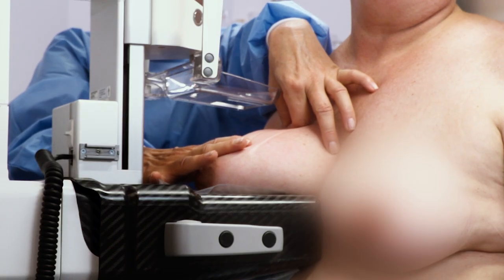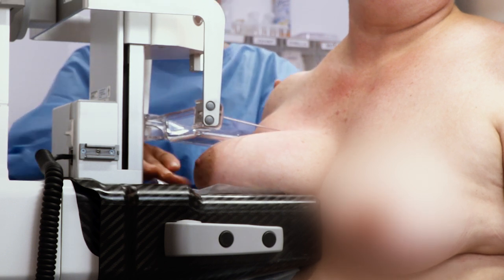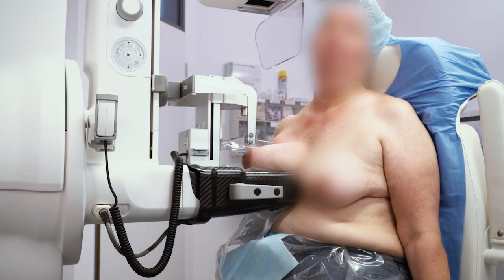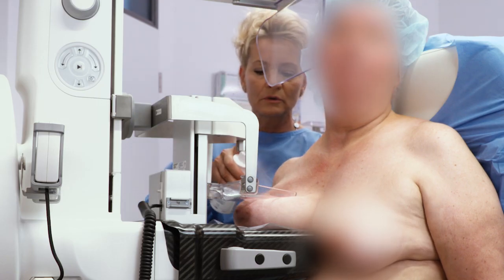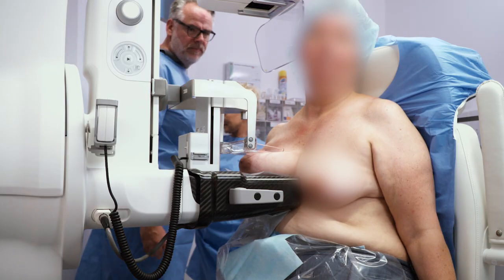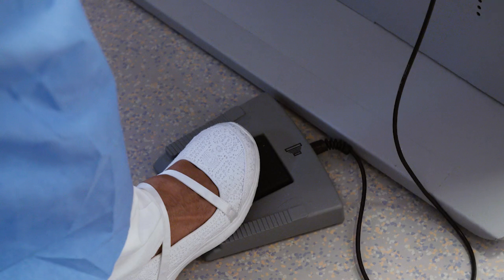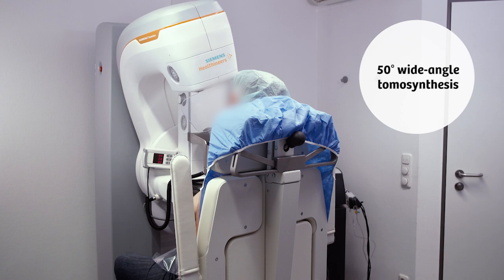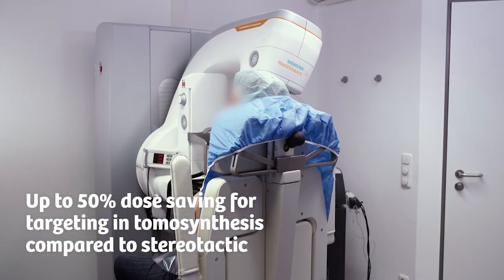Compared with previous examination time slots and times needed for stereotactic vacuum-assisted biopsies, we now have significant improvements in the workflow. That's really due to the fact that, on the one hand, we have a tomosynthesis data set, so we don't need 2 images to localize our findings. And, on the other hand, using tomosynthesis to plan the biopsy reduces the risk of a geometric error source with stereotactic acquisitions. As a result, we have very few situations where we need to retarget, and that significantly shortens the procedure not only for us, but ultimately for the patient.